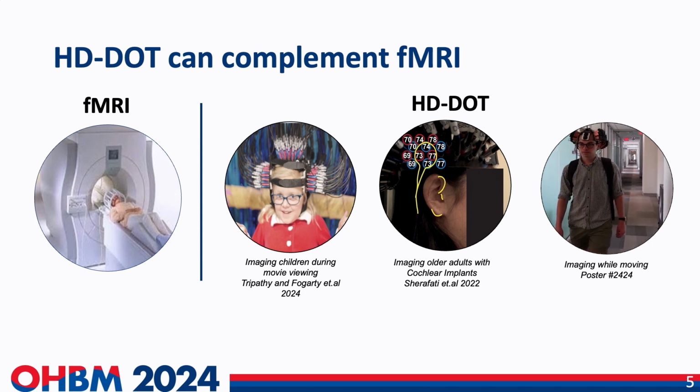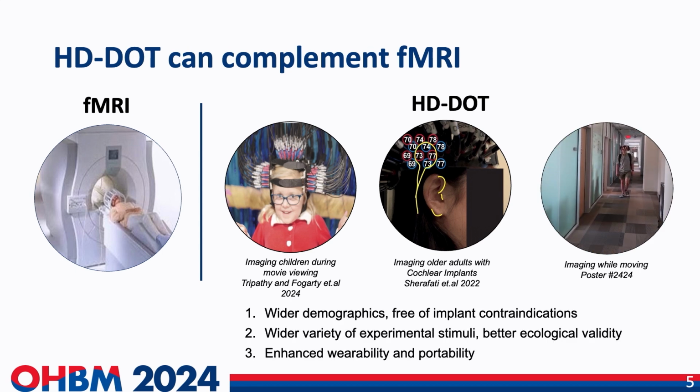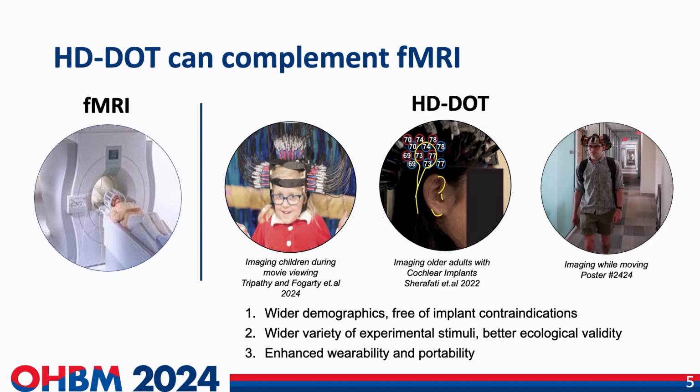We have a lot of posters from our group demonstrating all of these projects, so please do check them out later. So here's also a video of one of our newest systems where a participant is freely moving with the imaging cap on their head. And all of these features of HDDOT help expand the possibilities of non-invasive functional neuroimaging of the brain.